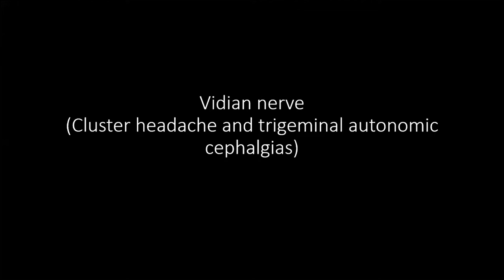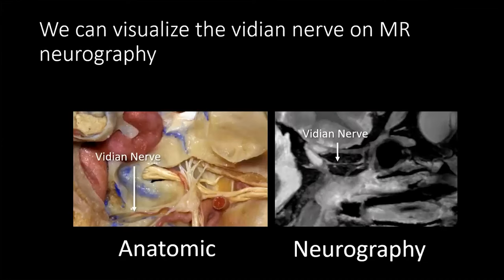The vidian nerve. So the vidian nerve is involved in cluster headaches. In fact, they used to be called vidian neuralgia before they got more fancy names. So one of the amazing things is we can actually see the vidian nerve itself on these MR neurography images.